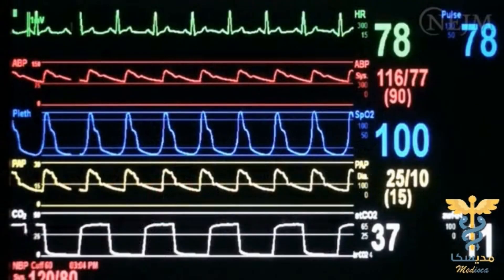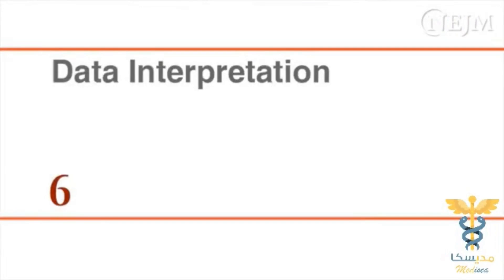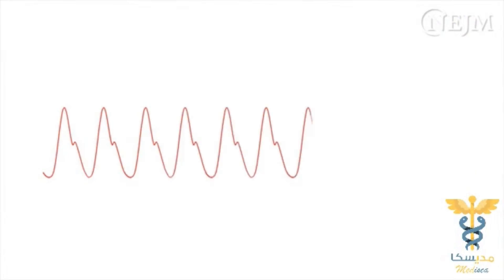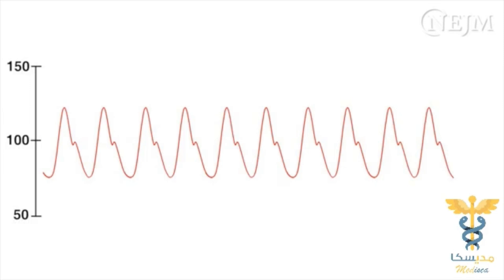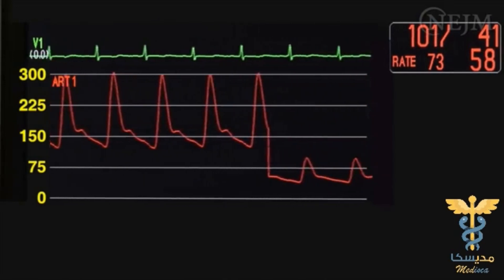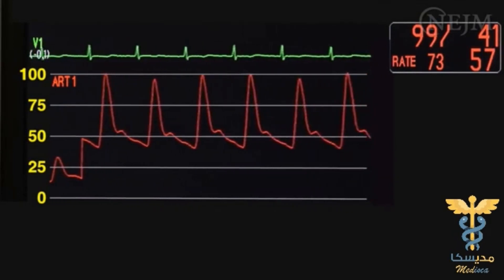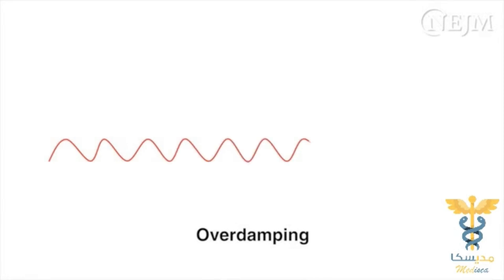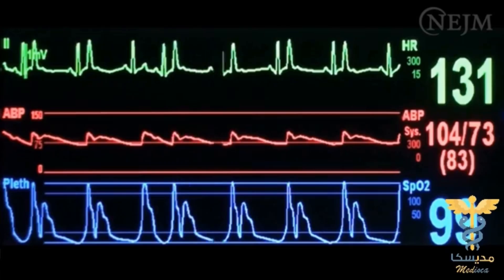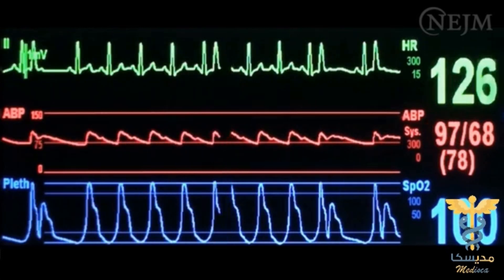All other electrical properties of the transducer were calibrated by the manufacturer and do not need to be readjusted before use. When analyzing a pressure waveform, always make sure that the transducer has been zeroed and leveled, and select an appropriate scale on the monitor. When the scale is made larger, the waveform appears smaller; conversely, when the scale is smaller, the waveform appears larger. Inspect the waveform quality to assess for possible overdamping or oscillations caused by underdamping. Compare the pressure tracing with the plethysmographic waveform obtained from the pulse oximeter and with the electrocardiogram to rule out the possibility of artifacts.